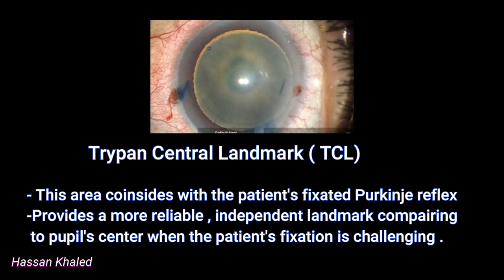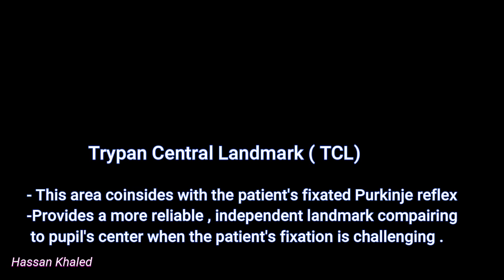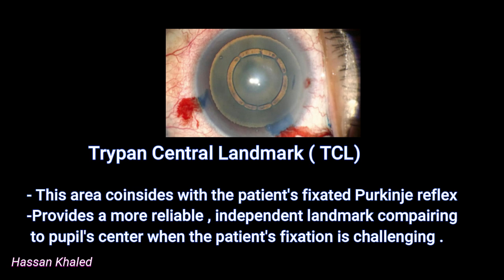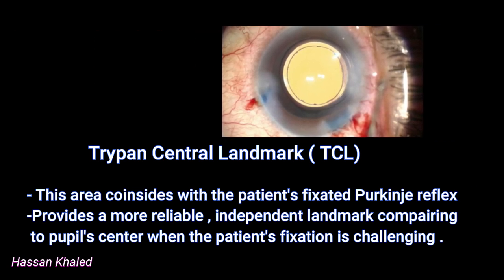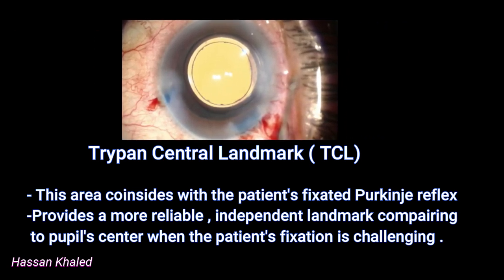Let's go to see another case. Here we can see a beautiful approximately 2 mm tri-band central landmark coinciding with the Purkinje image or Purkinje reflex. The capsulorrhexis is concentric with the tri-band central landmark; however, it is eccentric with the pupil center. Look at the result: a beautiful 360 degrees of symmetrical overlapping of the capsulorrhexis with the edge of the optic of the IOL.